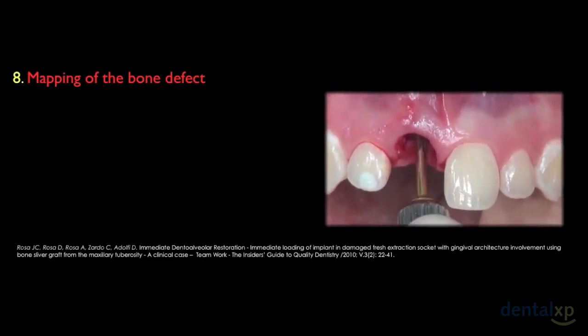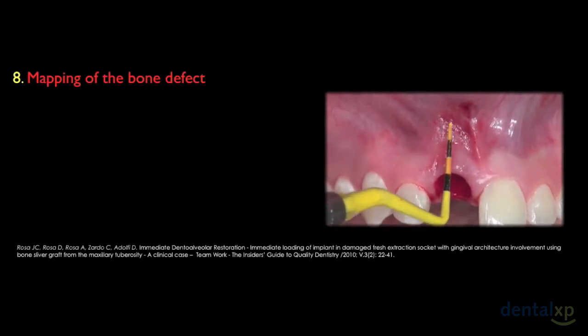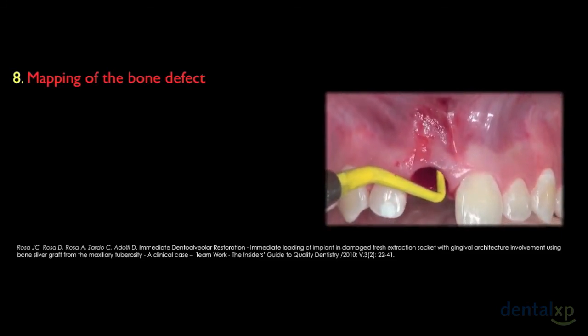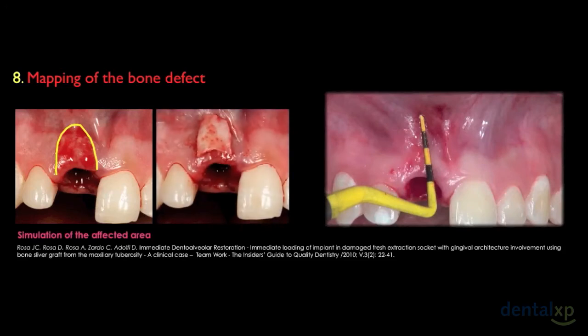Before we start bone reconstruction, we must insert the cover screw over the implant to avoid any residual bone entering the implant. We have to map the defect in the apical-coronal and mesiodistal aspects with a periodontal probe, measuring the defect in height and width. We can do a simulation of the affected area to transfer internal probe values to the external gingival aspect, using the blood clot from the socket — to know the extension of the bone graft and the shape of the bone defect under the soft tissue. Here we have the final graft dimensions according to the shape of the defect.